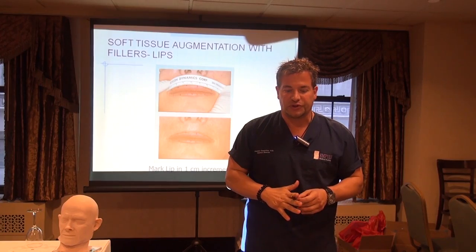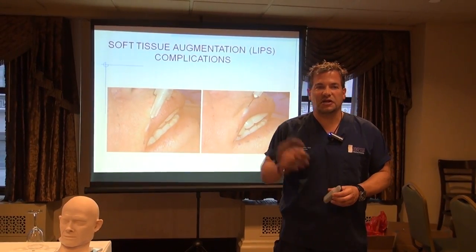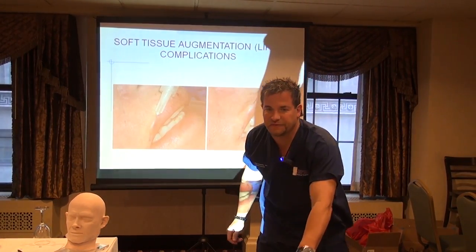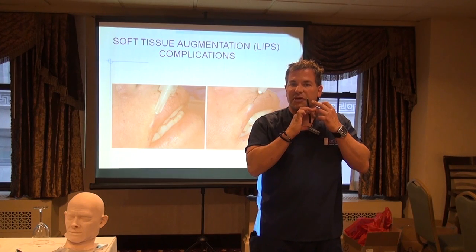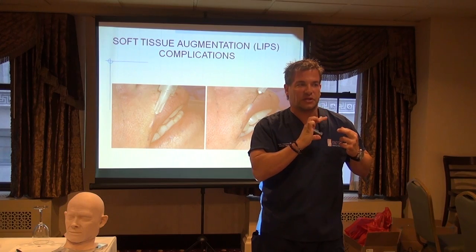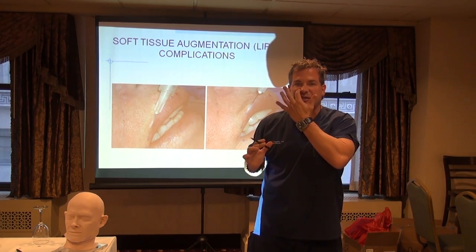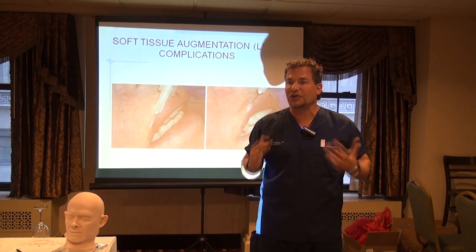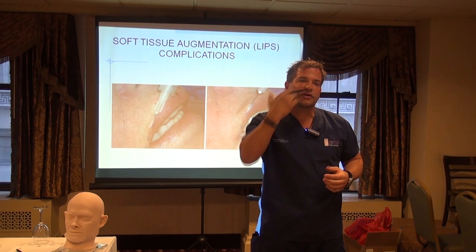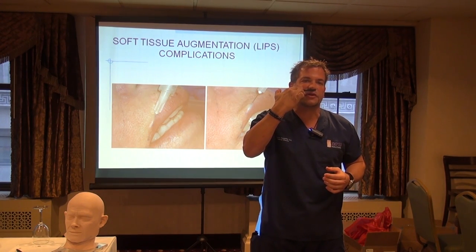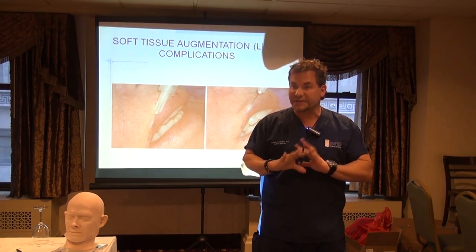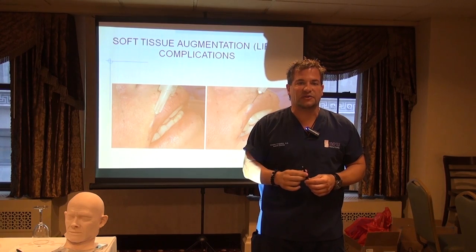This is a specific technique for injecting the lips — some people call it the push-through technique. With fillers, typically you advance your needle and lay down a thread of product as you pull out. That's the standard approach in the nasolabial fold area — called linear threading — and you can do the same in the lips. Advance along the vermilion border with a 30-gauge half-inch needle, depress the plunger, and lay the product down as you come out.